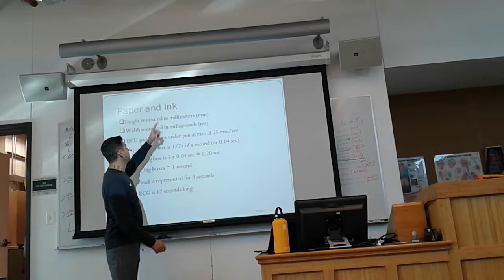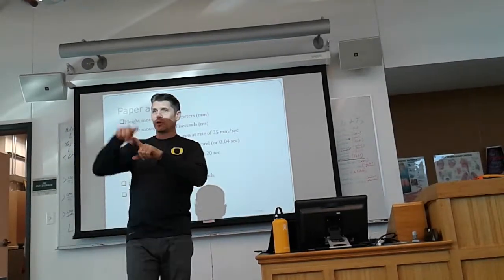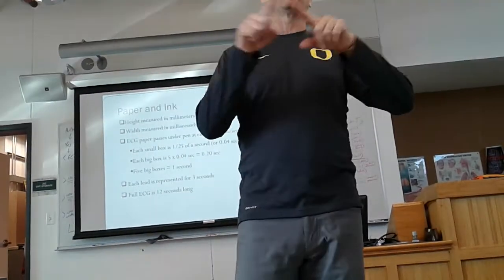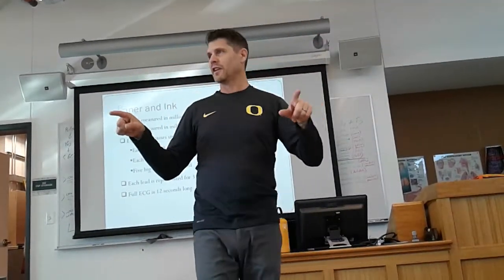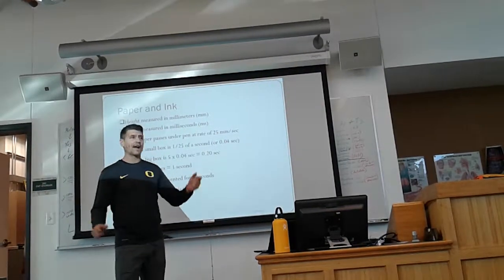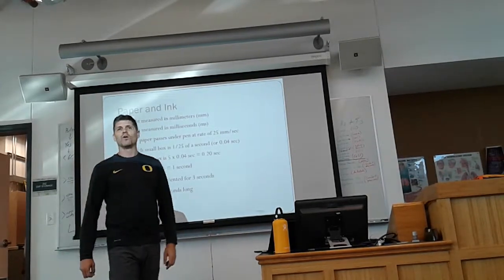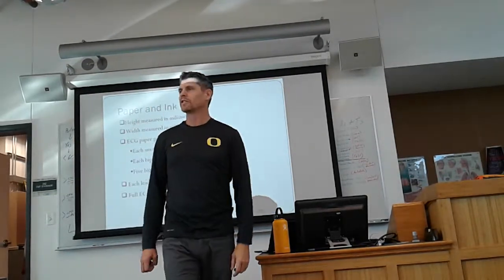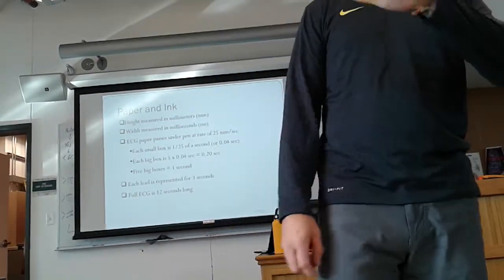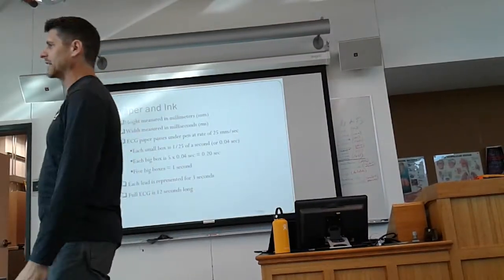So that's measured in millimeters. They are squares, so north and south is millimeters, and east and west is millimeters, but we don't measure in millimeters east and west. The unit that we're using is time as it goes from left to right, and that time is measured in milliseconds, or 0.04 seconds per little box. So it's measured in time. Every little box is 0.04 seconds.